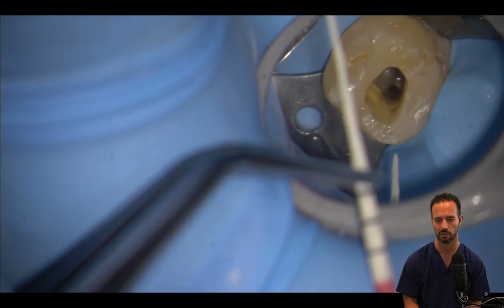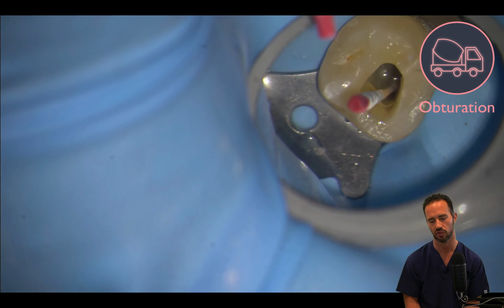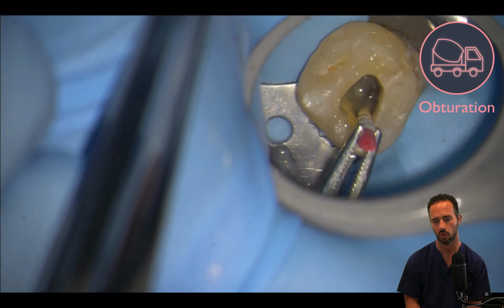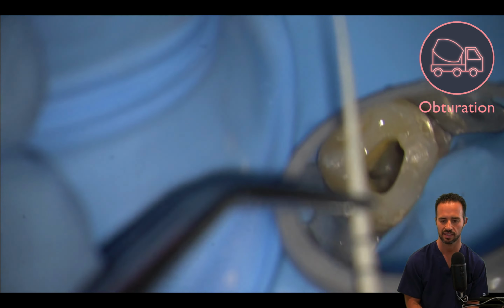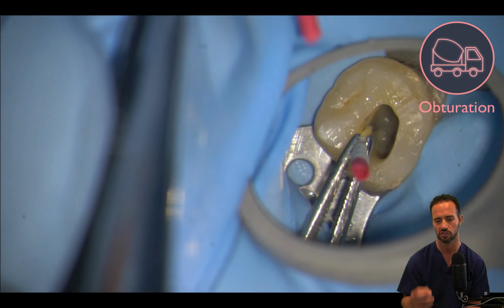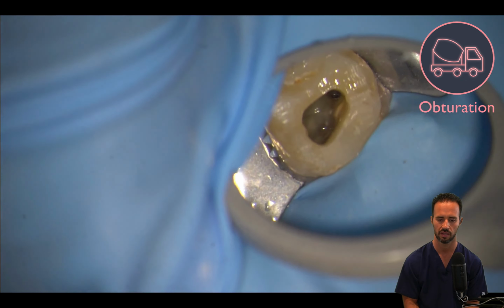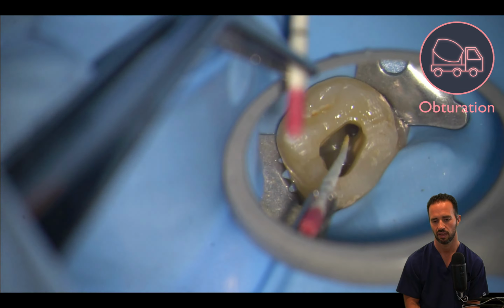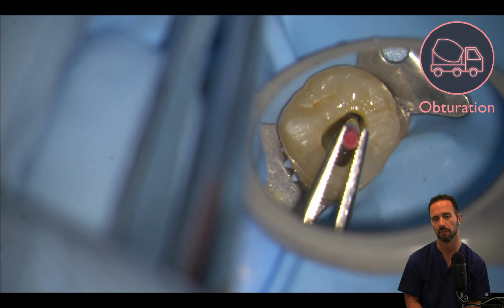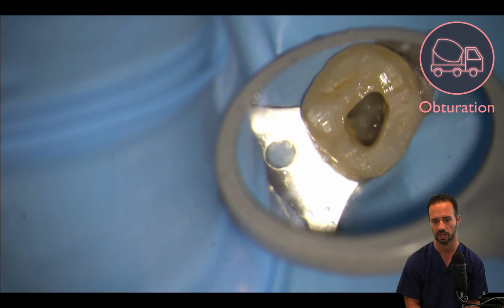And now we're aspirating out, and we're starting with our obturation phase of the treatment, which begins, as always, with drying out the canals with paper points. In this case, our Pro Taper F2 paper points. That's the red. In the distal buccal, and then finally in the palatal. And notice there's no more bleeding in that palatal canal. That tells us that we've got all that pulp tissue out.